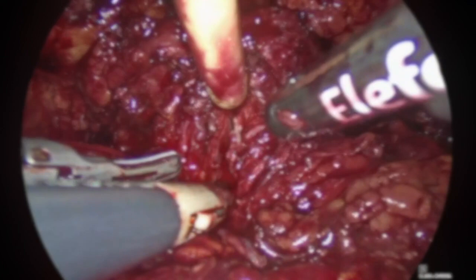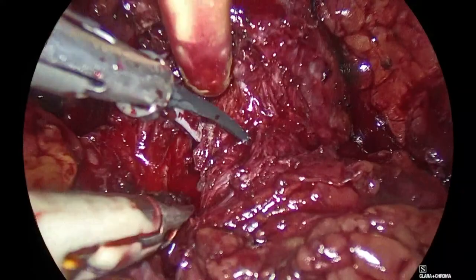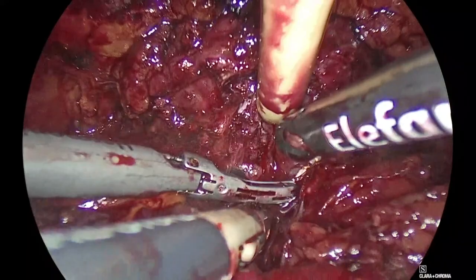So, come close, Padeli, close. See, there is no middle lobe here. We saw this in the CT scan, but also we can realize this. Padeli, rotate to the right. To the there. Good. Centralize. Inside, Panagioti. Inside. Left side, Padeli. Centralize. Zoom it down. Come close. Close.